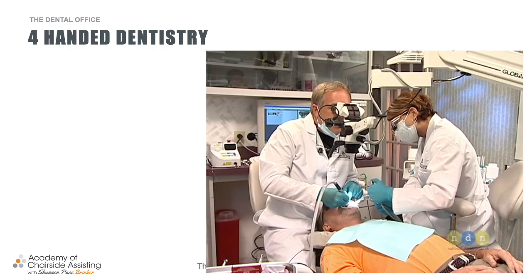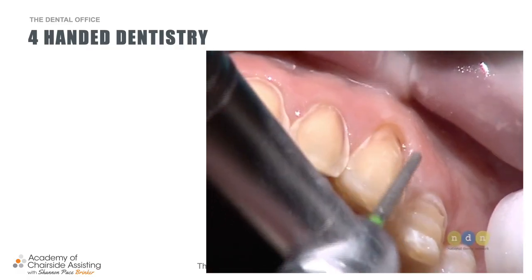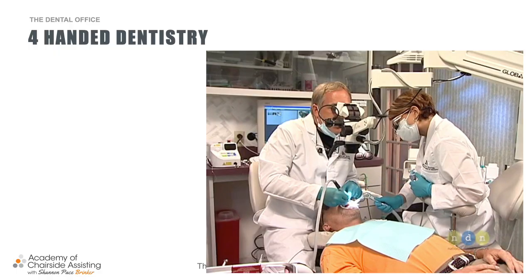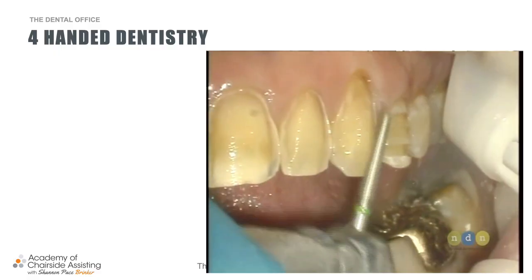But you see I'm holding that air water syringe. I'm higher than the dentist, although he is sitting up a little bit higher. Dr. Cranham is here in this video because he likes to use a scope. But my job is to keep everything nice and clean, right? But I never go over into his vision, okay?